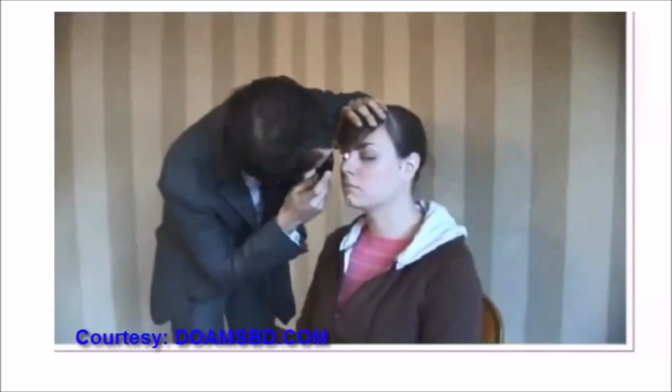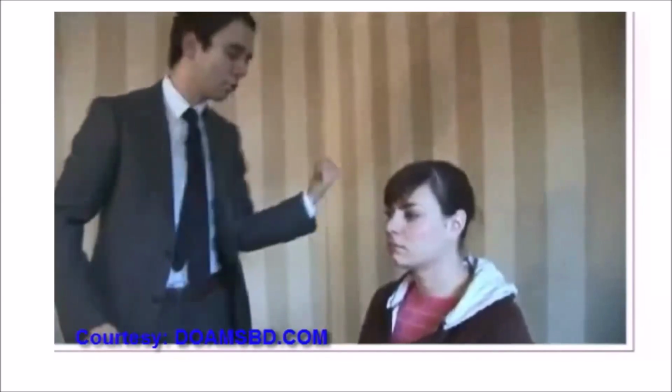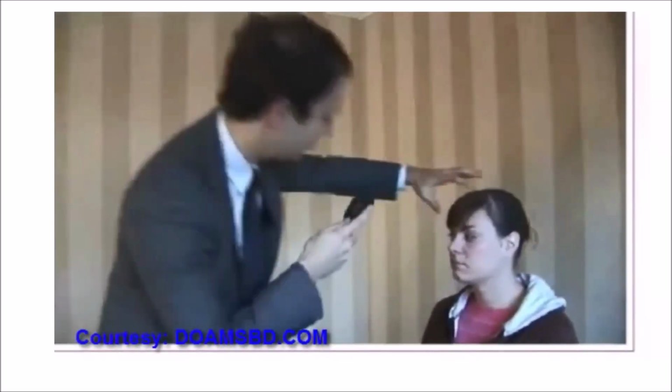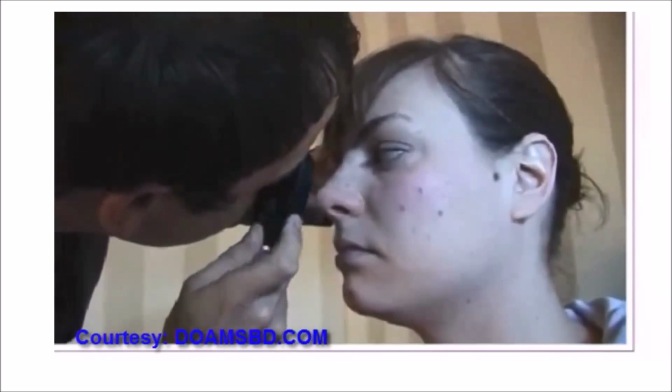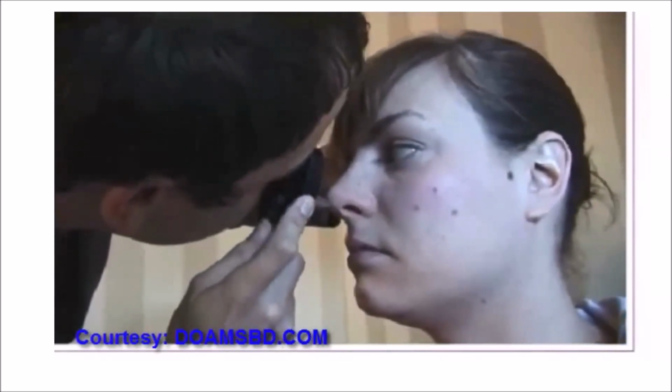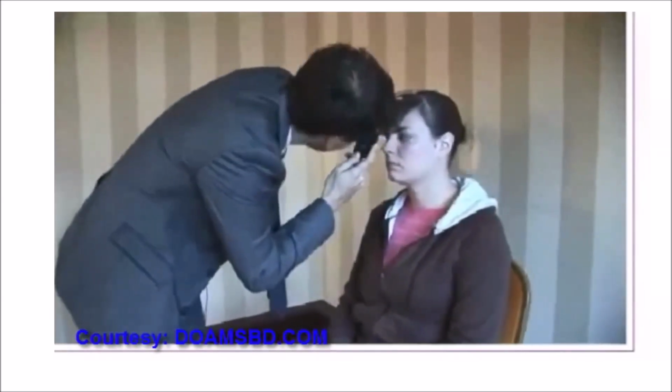Looking to different quadrants of the retina. That's great. And just all the way over to your right. Thank you. Checking the other quadrants. Okay, thank you. We'll just examine the other eye now.